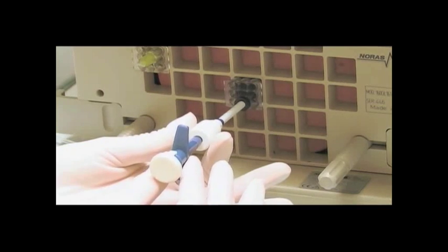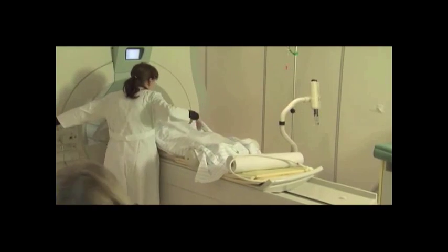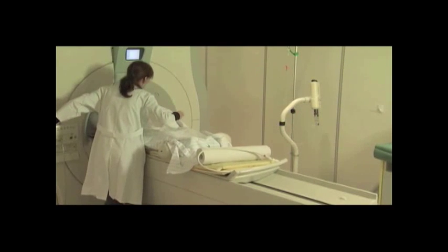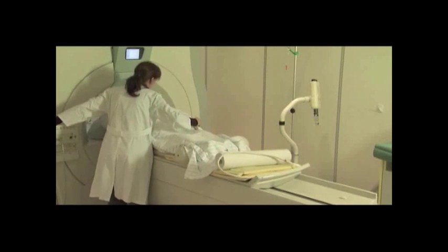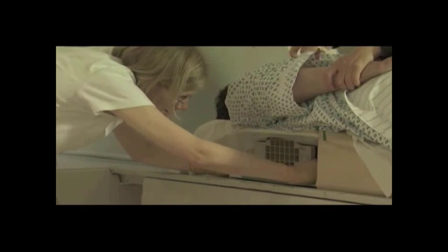Slowly remove the deployment device from the introducer sheath. Shuttle the patient into the magnet for verification of marker placement. Once the marker placement has been verified, shuttle the patient back out of the magnet. Gently remove the introducer sheath from the breast and grid.